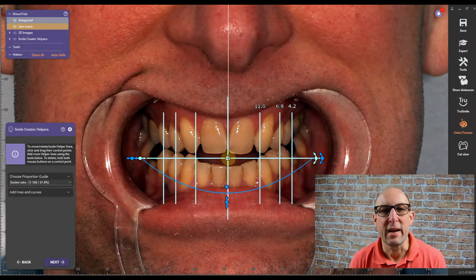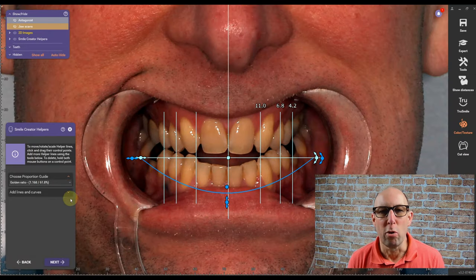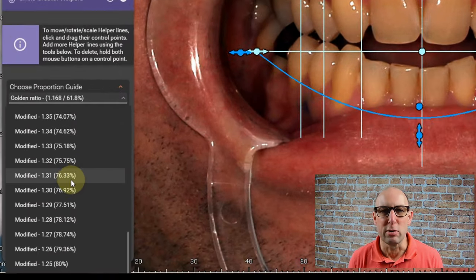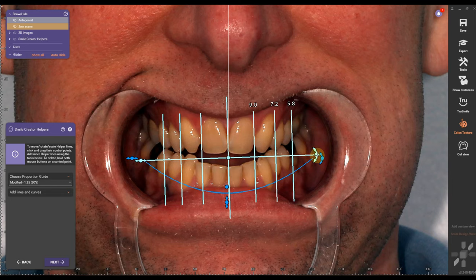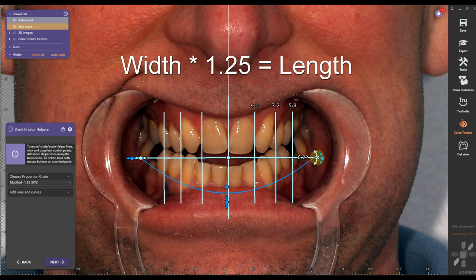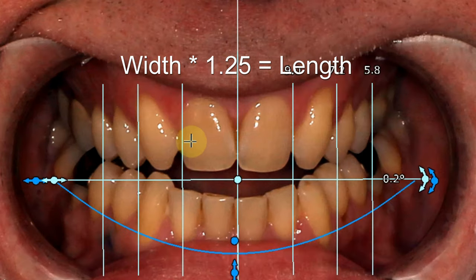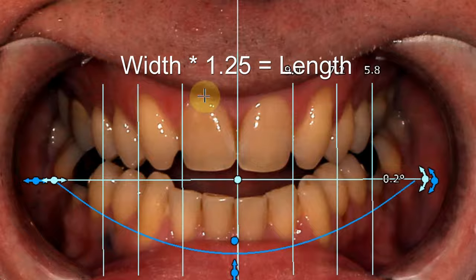Now we can orientate the golden proportion. I usually choose 80%, that is times 1.25. It's a very good measure if you have very abraded teeth — you just measure the width, times it by 1.25, and you have the ideal length, which is 80% of the central.